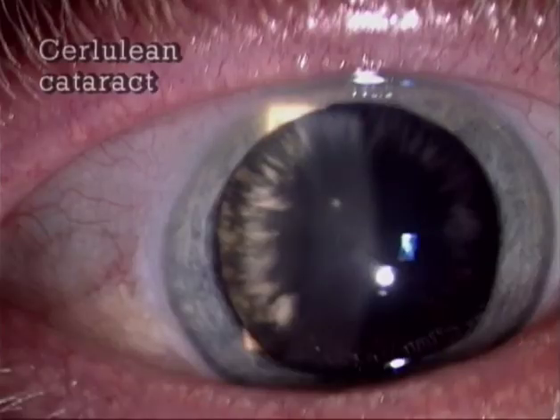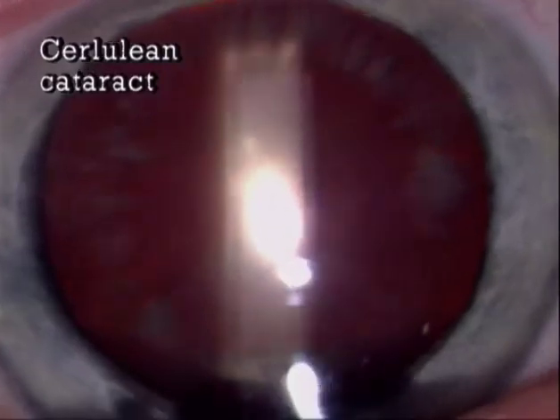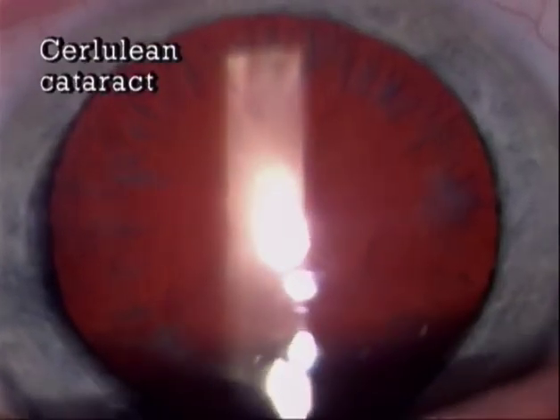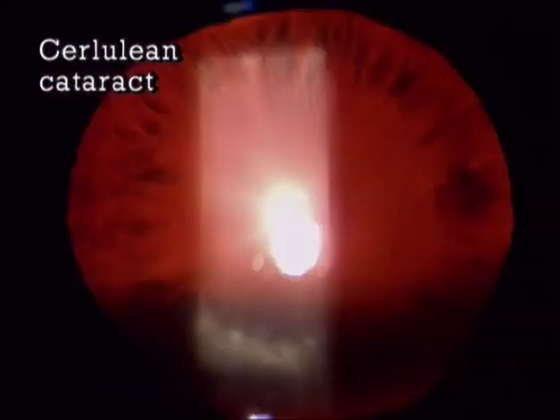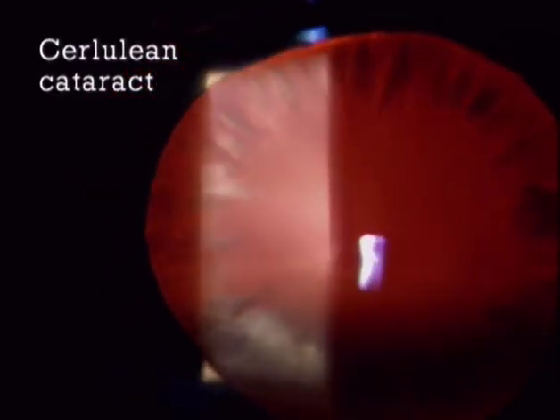An example is the analysis of cataractous changes, which all appear whitish in direct light. In retroillumination, some of these changes disappear because they are transparent, and their whitish appearance was then due to light scattering. Others appear black in retroillumination because they are truly opaque. The difference between direct light and backlight is thus seen here.